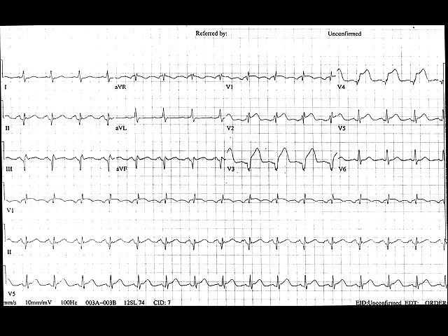This tracing was taken from a 67-year-old man who presented with severe chest pain lasting 5 hours. What do you notice? The most striking abnormality is ST elevation in leads V1 to V5, greatest in lead V4 at 4 to 5 millimeters.